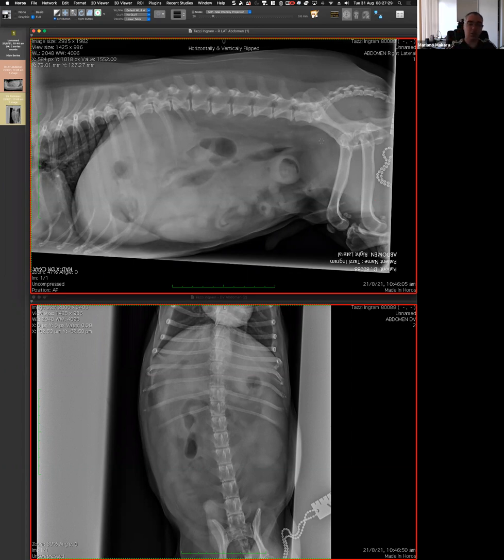I understand your situation. I'm going to go and grab the probe. What's the question that you want to answer from these radiographs? Where are you going to put the probe? What's your hypothesis? What is going on? As you said, just differentiating between, is this small bowel or large bowel? We think it's small bowel from its positioning, and then I would confirm that with the architecture of the bowel with my ultrasound probe.